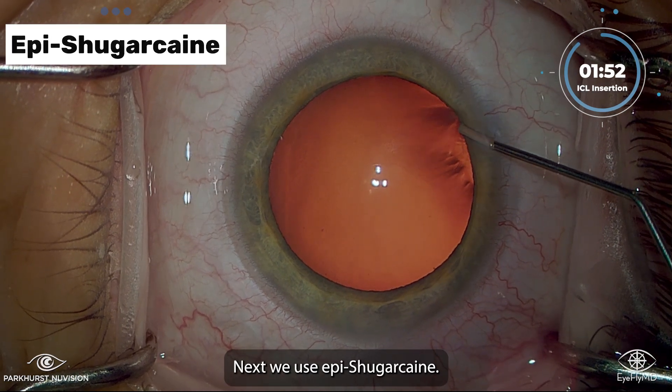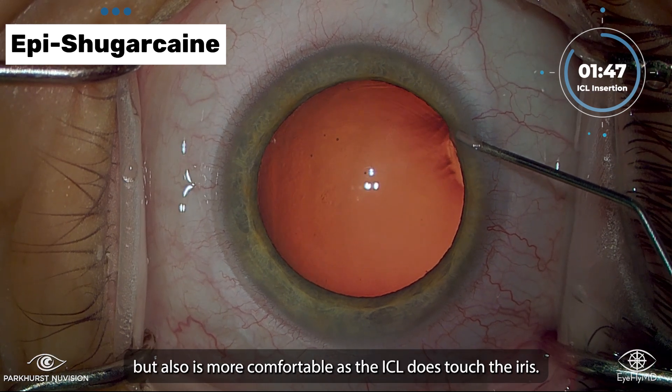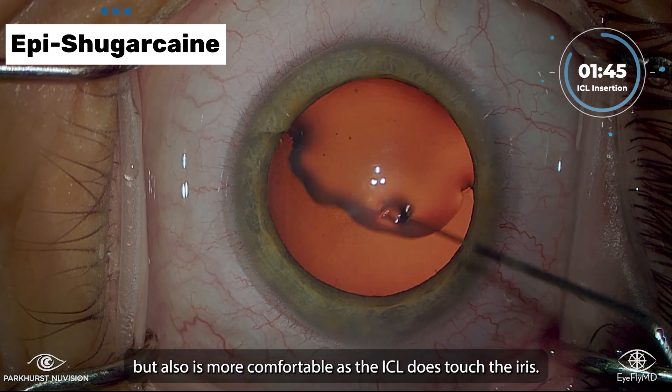Next, we use epi-Shugarcaine. This not only helps ensure adequate dilation through the case, but also is more comfortable as the ICL does touch the iris.